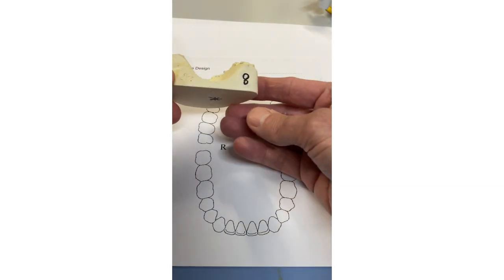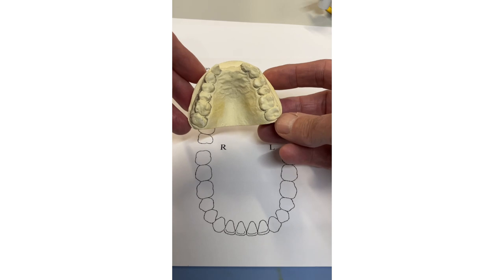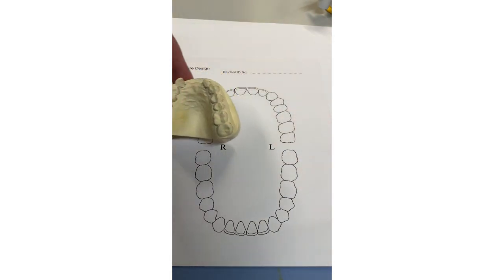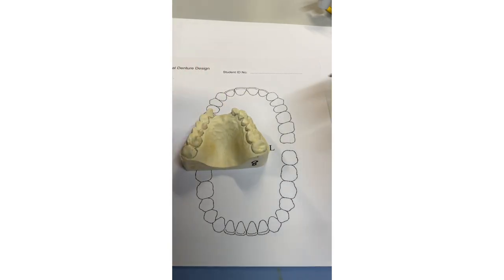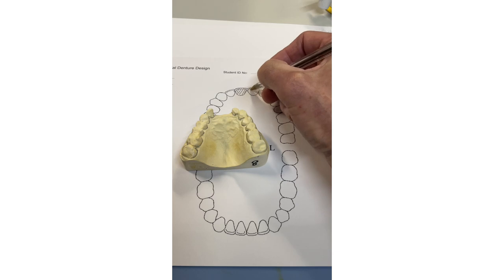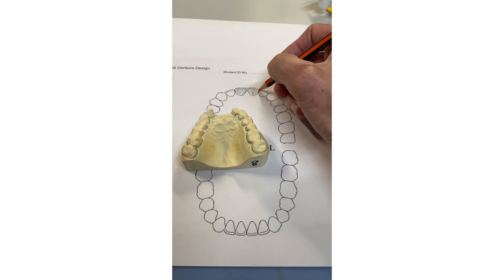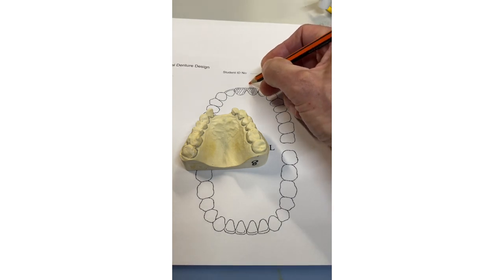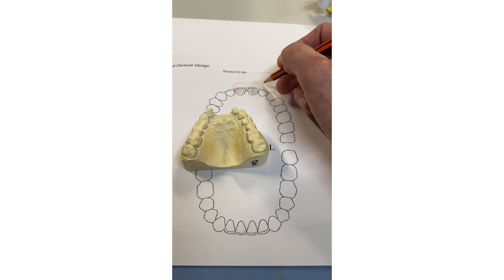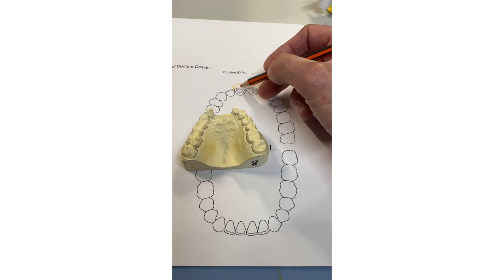Case number eight — Kennedy Class IV. This is difficult. First, hash out the missing teeth — we've got two central incisors missing, so just hash these out. What you need to be aware of is what's going to keep this denture in. The flange is going to keep the denture in because it'll go into soft tissue undercut, and the contact points here and here will provide retention anteriorly.